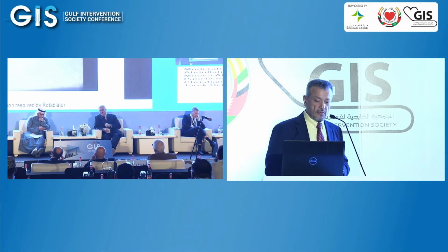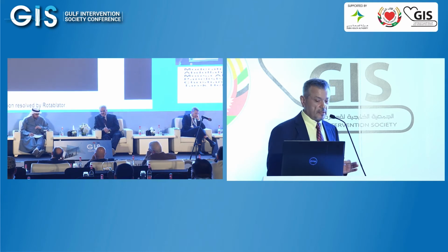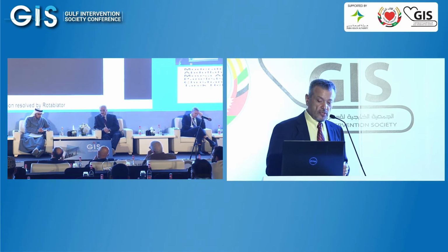Okay, this is the 2-millimeter balloon, but big mistake. What I did, I made it much worse. Now I have no crossing ability. The balloon made my initial leakage into a big perforation, and I had to deal with it. So I just bought time by putting a balloon proximal to the occlusion and gave myself some time to think.